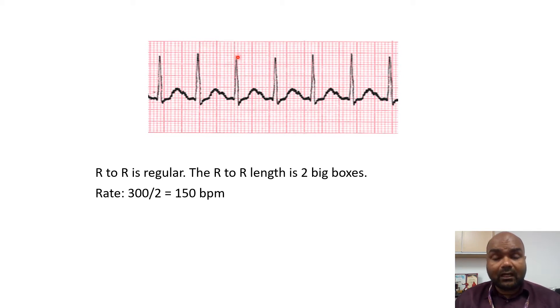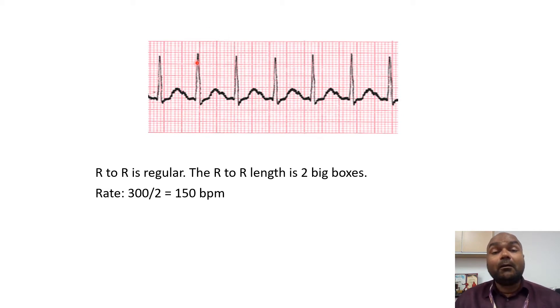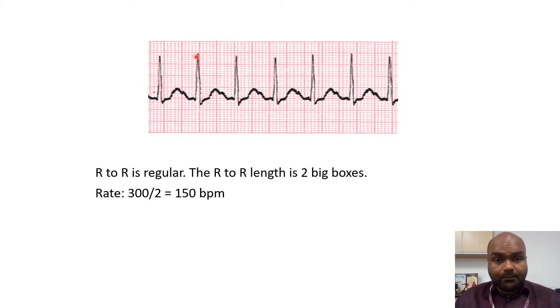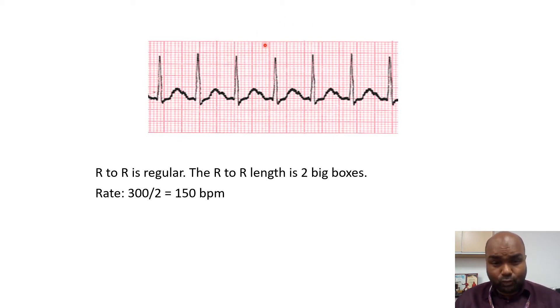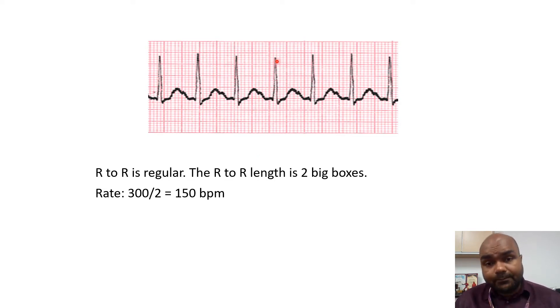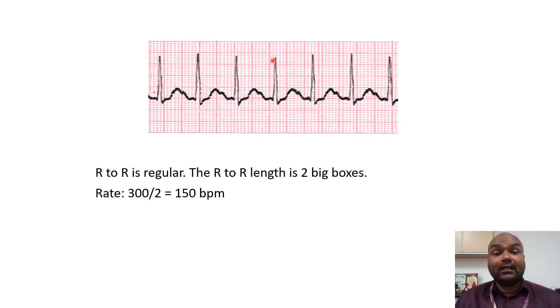One R interval to the next R interval represents one heartbeat. We look at how many big boxes one heartbeat covers, then take 300 and divide by that number of boxes from one R interval to the other to get the heart rate. In this example, the R-R interval covers two big boxes: 300 divided by 2 gives a heart rate of 150. If it's three big boxes, 300 divided by 3 gives a heart rate of 100. In this case, the heart rate is 150, so this patient is having tachycardia.